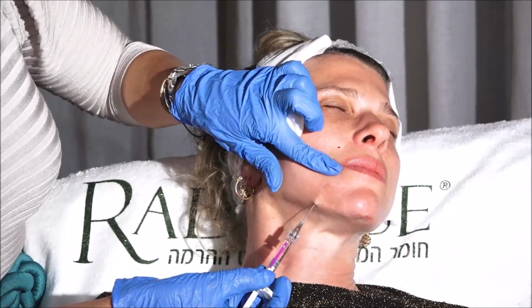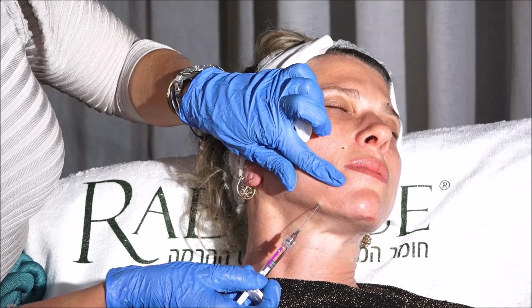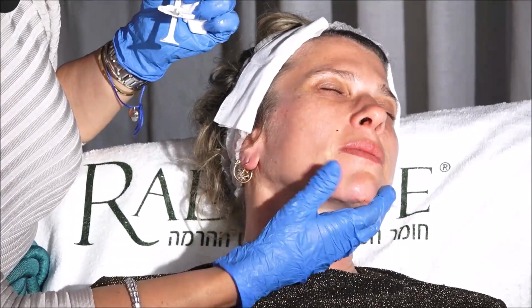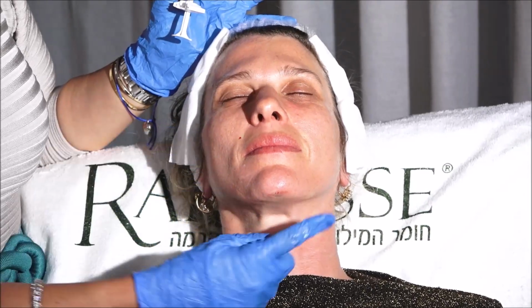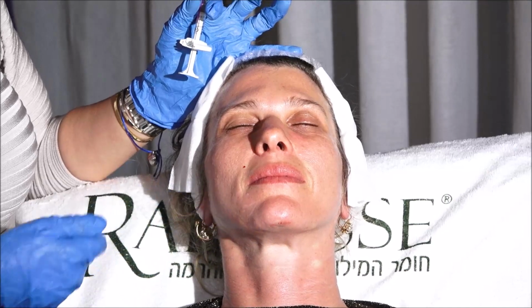This is what I need to feel, the resistance. And I gave 3 small boluses here. What I want to do is to blend this emptiness here to the new chin I added to her.